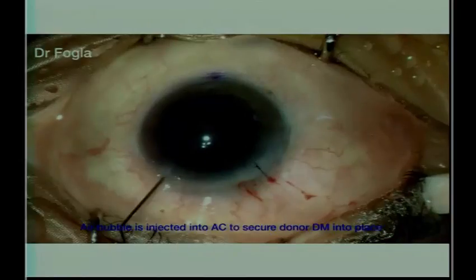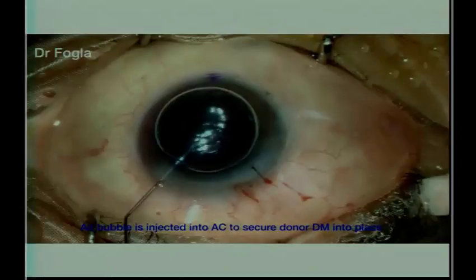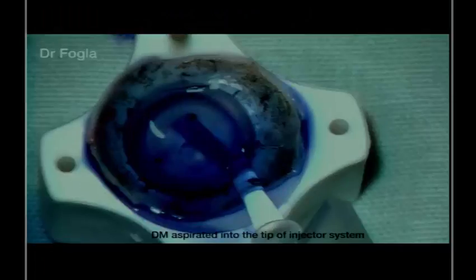I use a 30 gauge cannula. You make sure that you get one bubble, you don't get fish eggs, because sometimes if you get fish eggs, these small bubbles, they can displace the Descemet's to the peripheral angle. That's again just to show you another video.